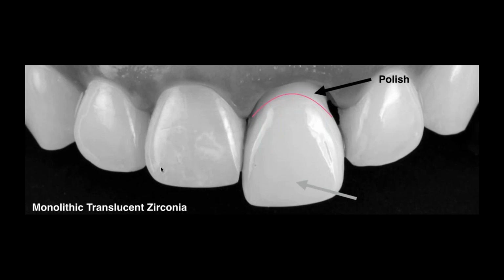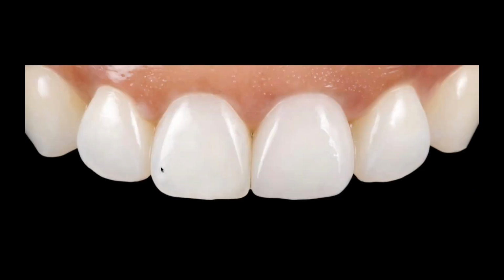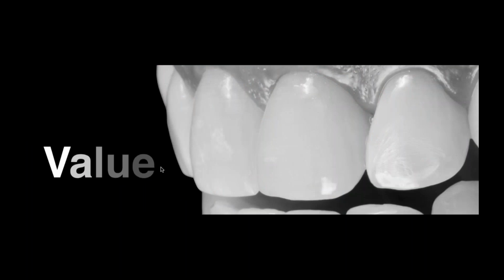The clinical crown, of course, you can add some ceramic if you want, you can add some stains if you want, and glaze it for sure. But after you finish the glaze, you get the restoration out of the furnace and repolish that neck of the crown. That subgingival aspect needs to be always polished. So you can see with the soft tissue that is maintained, even a monolithic zirconia can look really, really nice. And what is the key? To make sure you match the value, the grayscales.